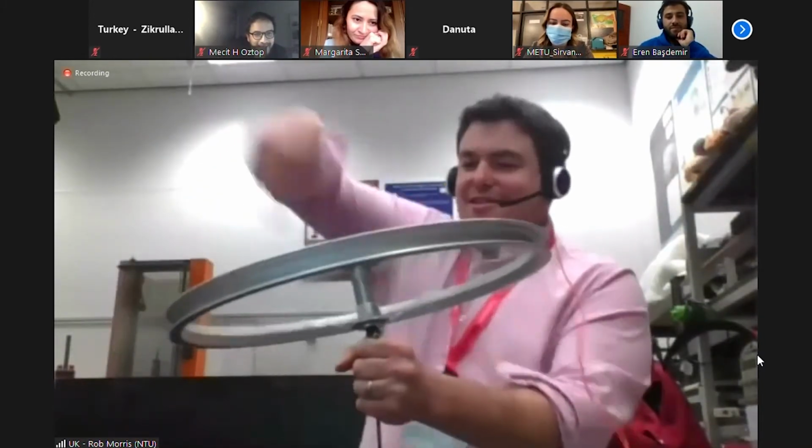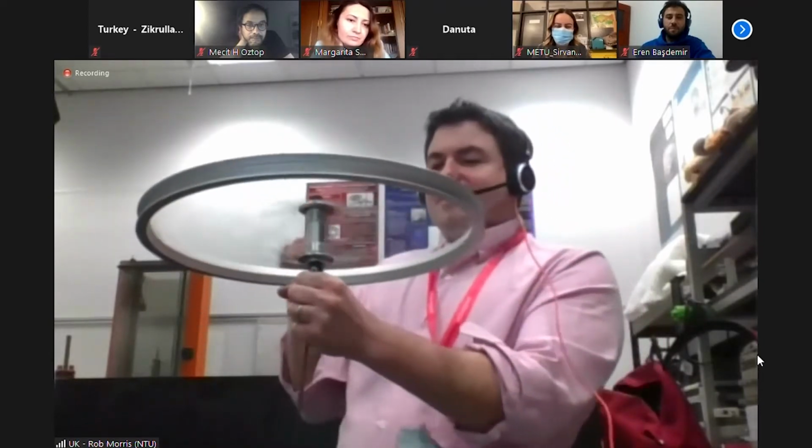So here is my bike wheel spinning round. Now, angular momentum is a strange property, and its definition actually is that for a thing that's spinning around like this, angular momentum counts as poking out of the end, which is peculiar, but it works for the physics, so we're just going to go with it. So we'll spin it round, we'll give it angular momentum. In a proton, it always has angular momentum. Fortunately, no one is inside your body poking protons, spinning them round, trying to give them angular momentum. It's stuck there always. This, however, loses angular momentum, which means that the analogy is not perfect.